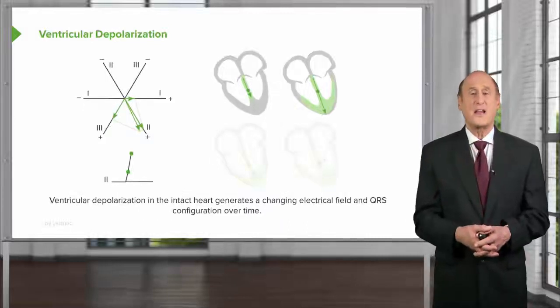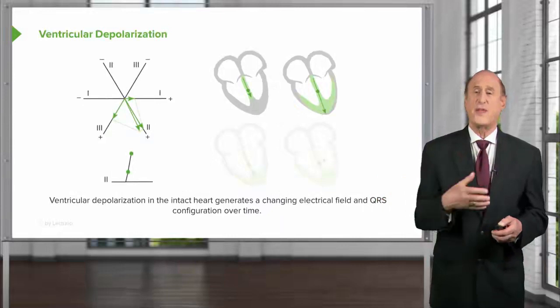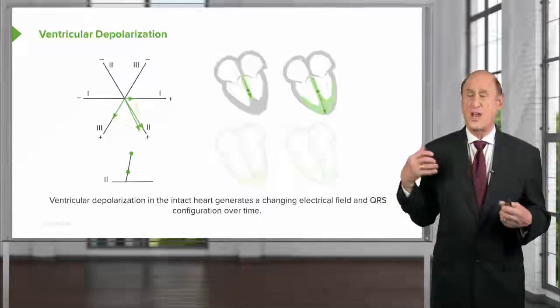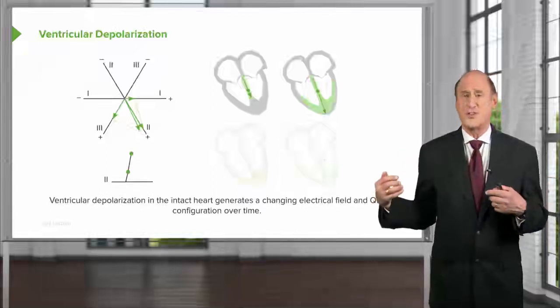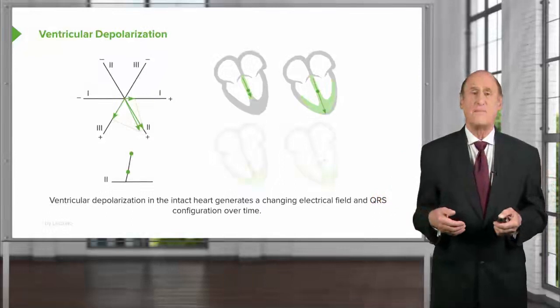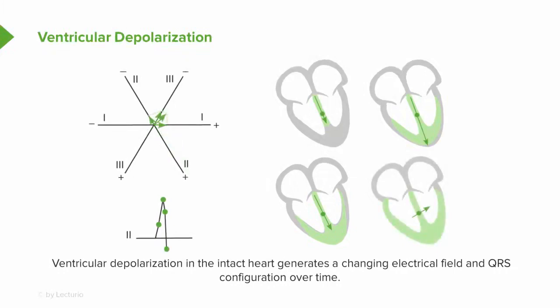Depending on where the electrode is looking, if the electrode's looking from here, it's going to see different than if the electrode's looking from here, because the wave of depolarization will be coming towards this one at a certain point when it's going away from the one over here, and vice versa. And we'll see some examples of that. And here in the continuum diagram, you see the wave of depolarization passing from the apex back up to the base until both the right and left ventricle have depolarized and have contracted.